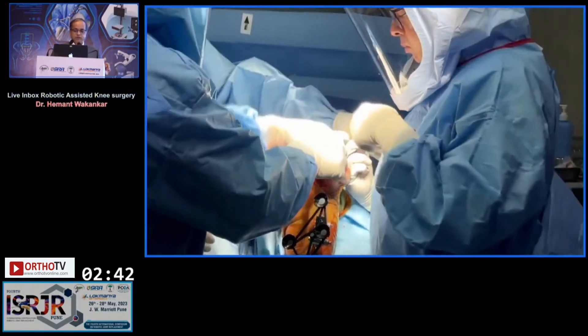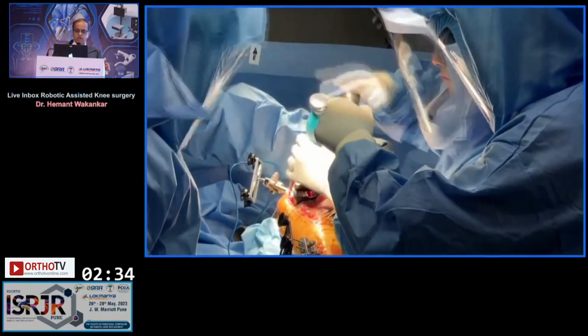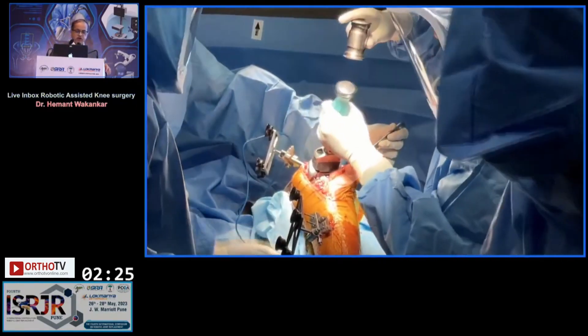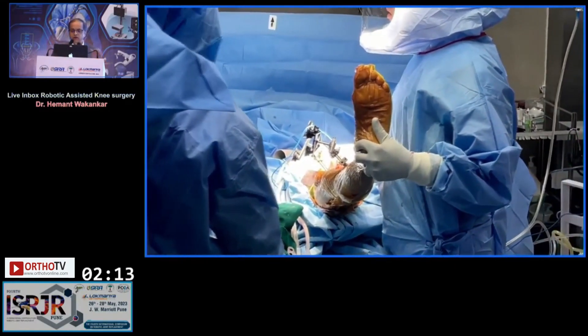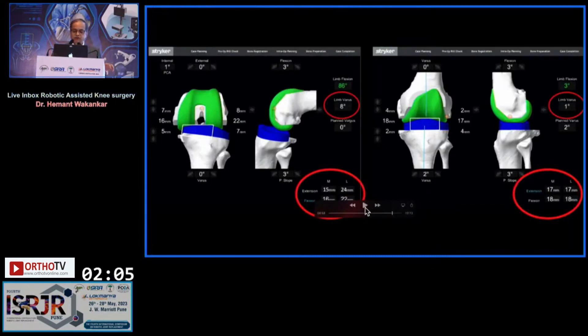Next is the 9mm trial poly going on — this is ultra-congruent, not posterior stabilized. This is the triathlon femoral component going on. Then we get it out in extension and check the medial-lateral balancing screen in full extension and then in flexion as well. On the trial reduction screen you can see where we started: 24mm in extension laterally, which we've now got down to 17. In flexion it is 18, and it is beautifully balanced. So this is basically from 8 degrees of varus, we've got back to 1 degree of varus — balancing and alignment are right.